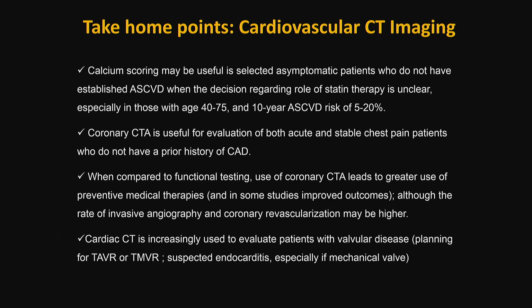The second point is that coronary CTA is useful for evaluating both acute and stable chest pain patients who do not have prior history of CAD. I showed you some data that in the stable chest pain patients, there is a reduction in the rate of myocardial infarction in the trials that compared patients who underwent CTA versus functional testing. On the other hand, when patients are randomized to CTA, there is an increased risk of invasive angiography and coronary revascularization in most, but not all studies.